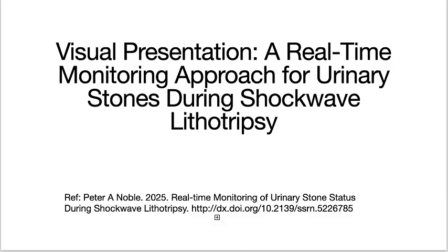Sure. Urinary stones cause severe pain by obstructing the flow of urine, leading to swelling, inflammation, and intense discomfort in the urinary tract. Shockwave lithotripsy is a method used to fragment urinary stones into small pieces so that they can naturally pass out of the body. Does that make sense? I am still confused.